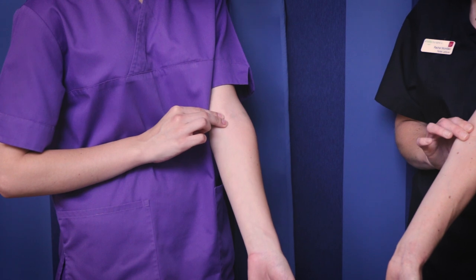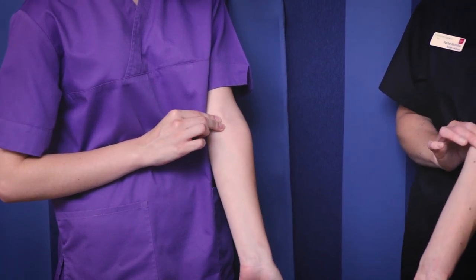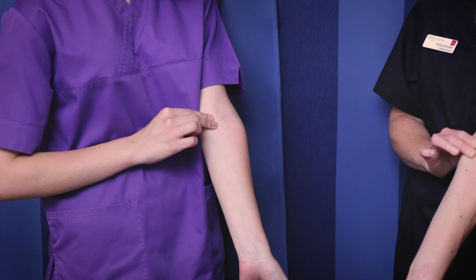Sometimes it can be difficult to feel on some patients. So if you extend the elbow a little bit more, sometimes that helps to find the pulse.